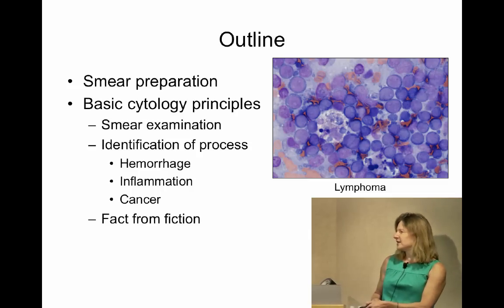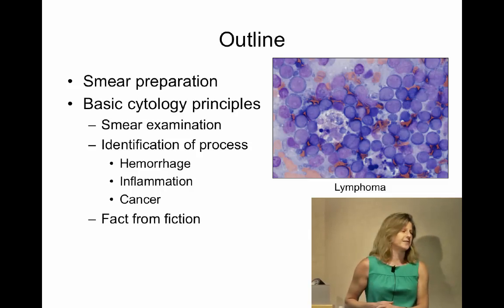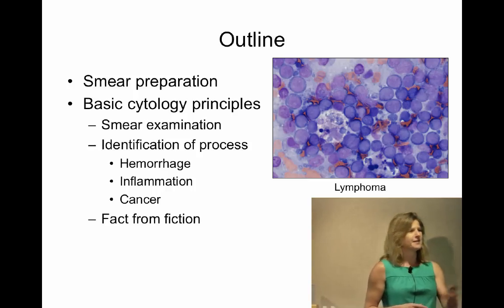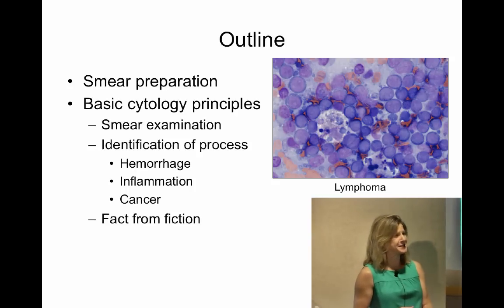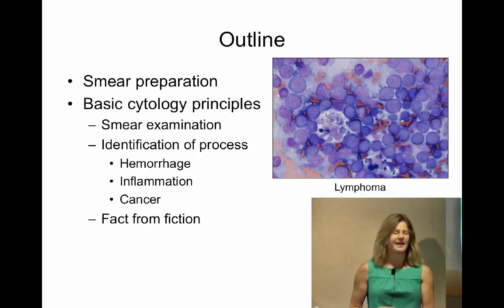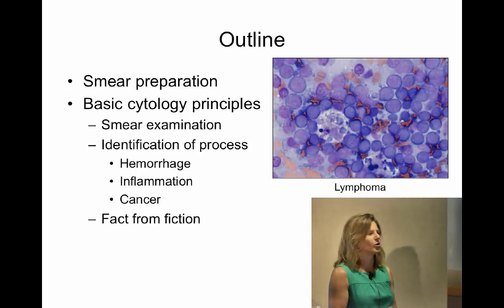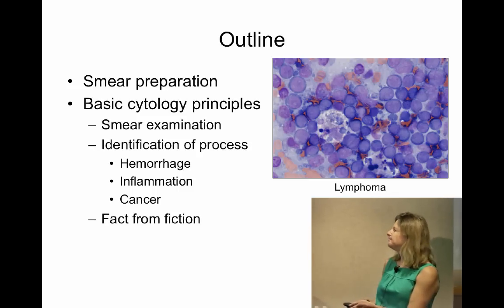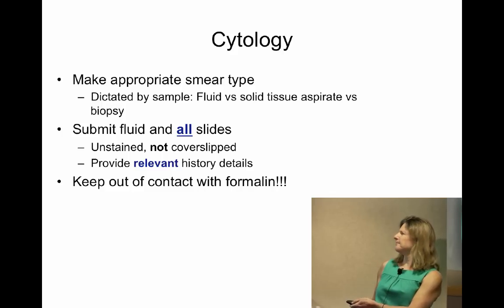And again, you know, in cytology, even more than hematology, we have to tell fact from fiction, and there are things that mimic infectious agents all the time. There's things in urines that mimic infectious agents that we're like, oh my God, what are you? And a lot of it is match the picture, or, you know, what do I recall having seen a case 10 years ago? And what did I do with it at that time?